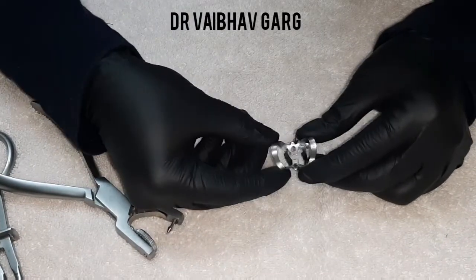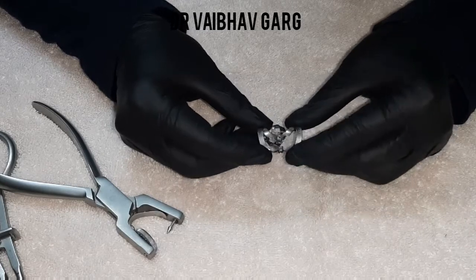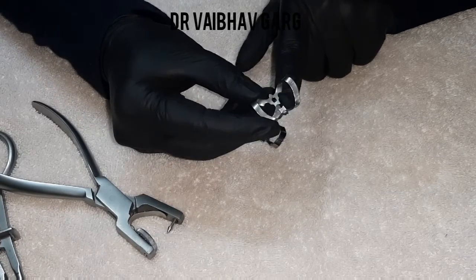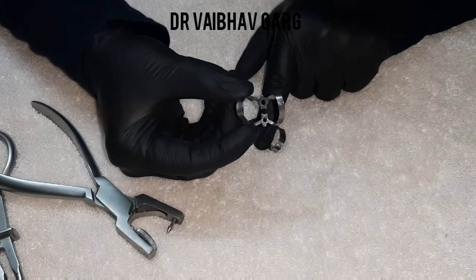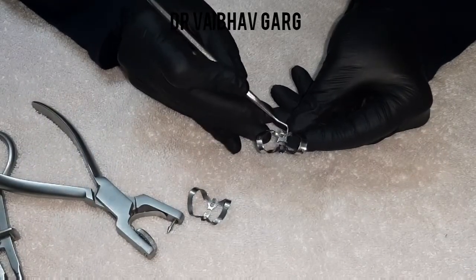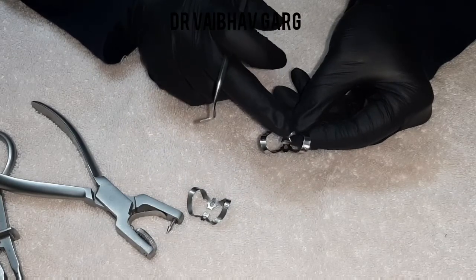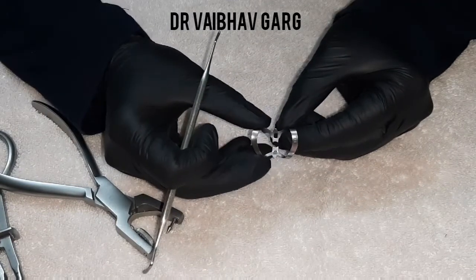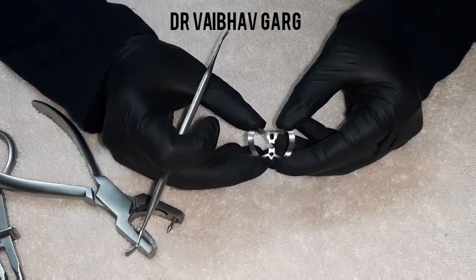Butterfly-shaped clamps are mostly for anterior teeth. When the forks are very close and similar in size, these are for lower anterior teeth and maxillary lateral incisors. When there is a bigger area on the clamp, it is mostly used for the incisal surface of maxillary central incisors. A small trick: in case your clamp is not fitting for the lower premolars, this clamp can come in very handy and can be used there.